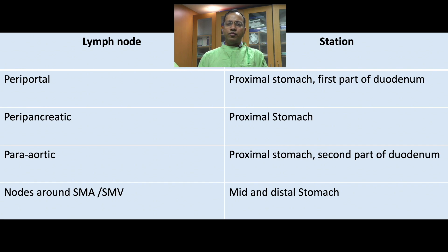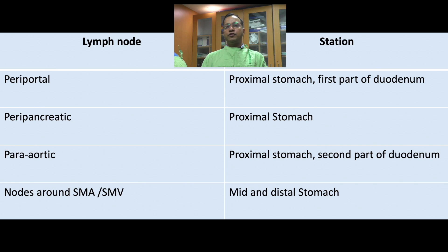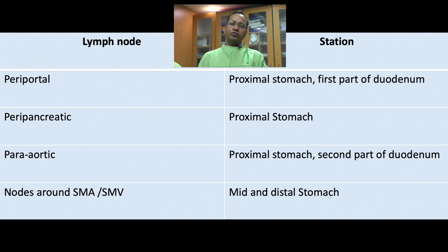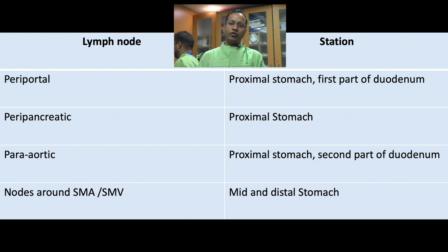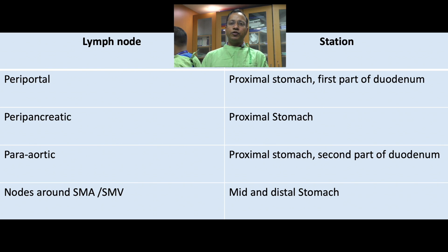We will also cover para-aortic lymph nodes, or lymph nodes which are around the superior mesenteric artery or superior mesenteric vein. These nodes can be evaluated from the proximal stomach, distal stomach, first part of duodenum, and second part of duodenum.